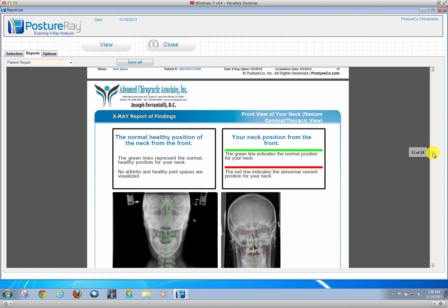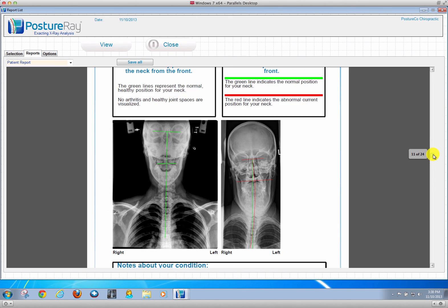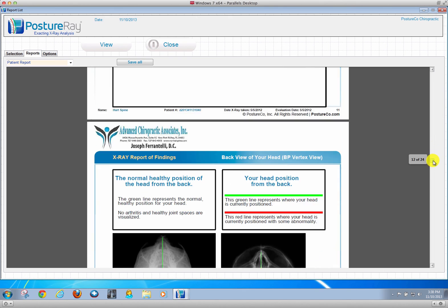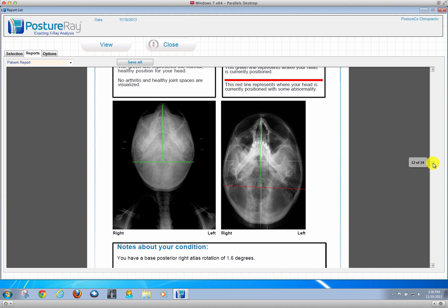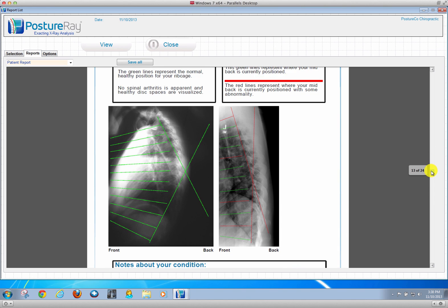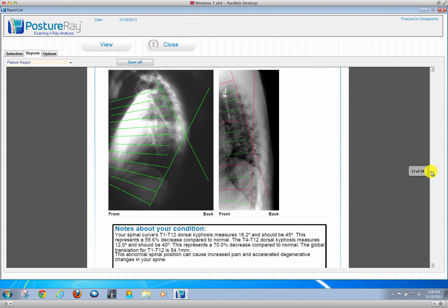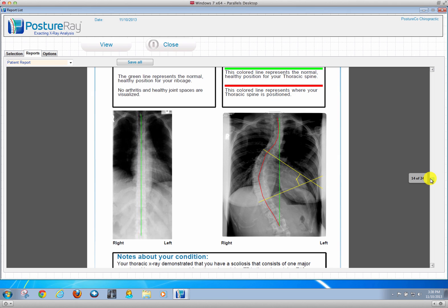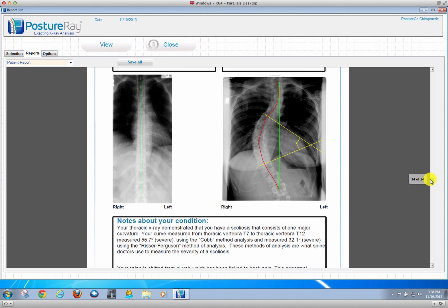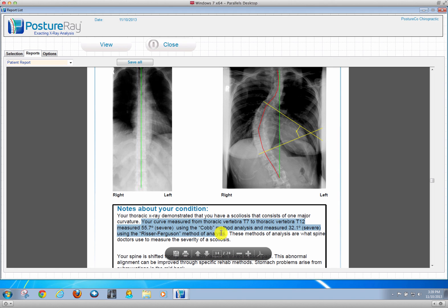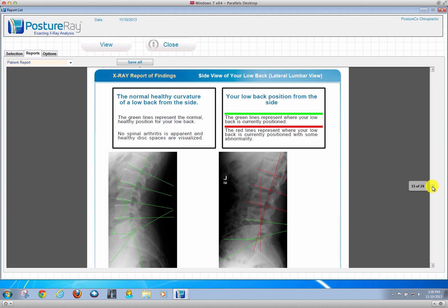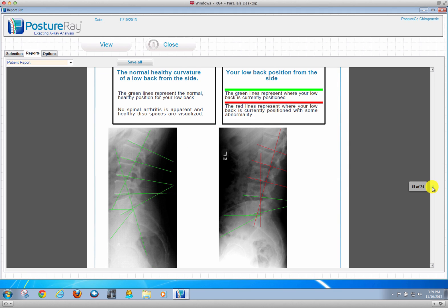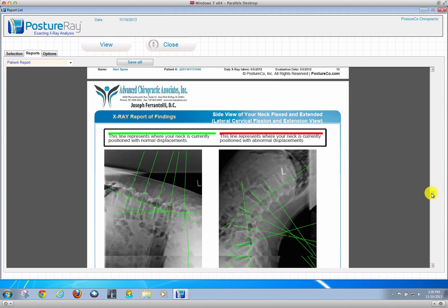AP Open, as well as the nasium, the base posterior, vertex, lateral thoracic. And even on scoliosis views, it automatically will calculate what their Cobb versus Risser-Ferguson is. They'll have the normal on the side. And then there we go with the laterals.